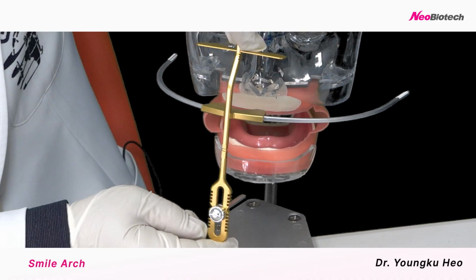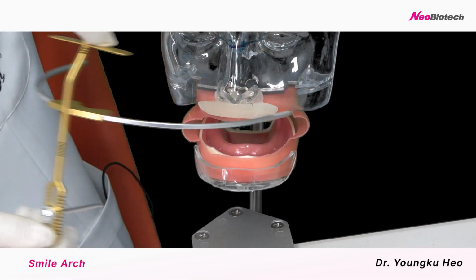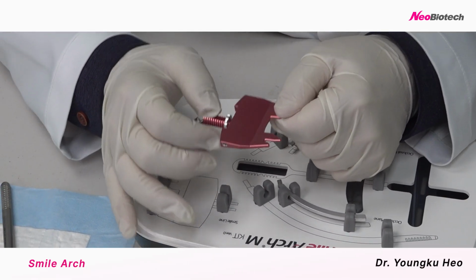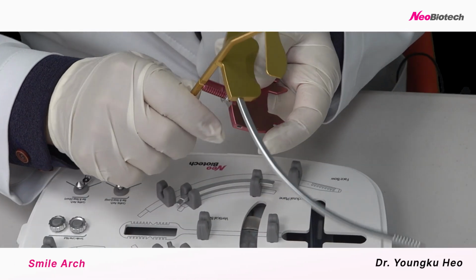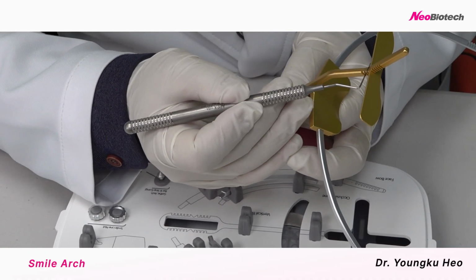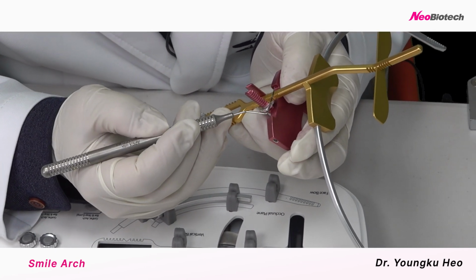And also, this is the smile line, beside a plate. All right. You can put this C point. Okay. If it is 1 millimeter, the same standard, you can put this line to match to this.